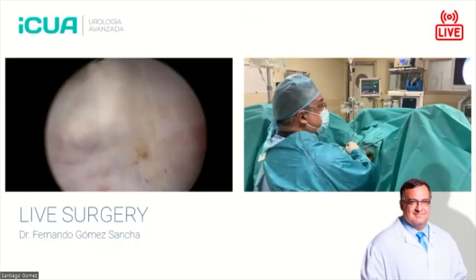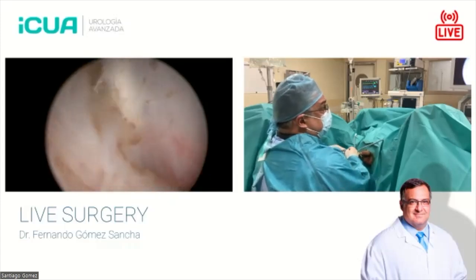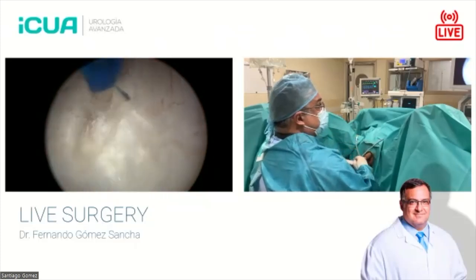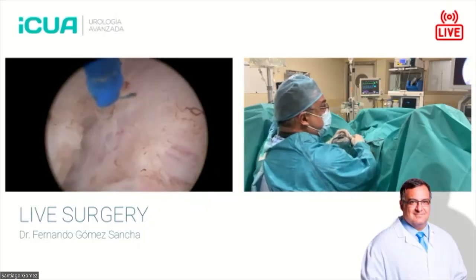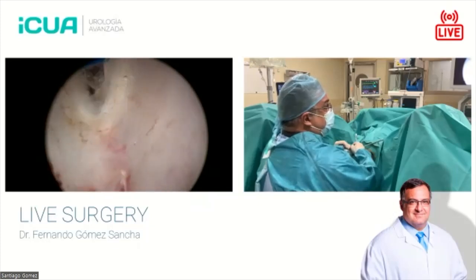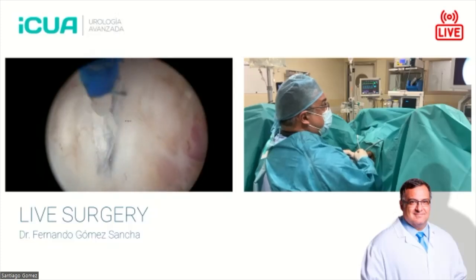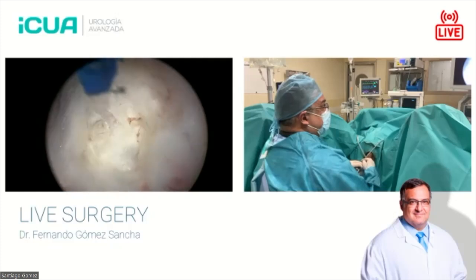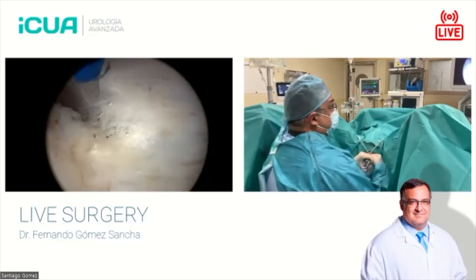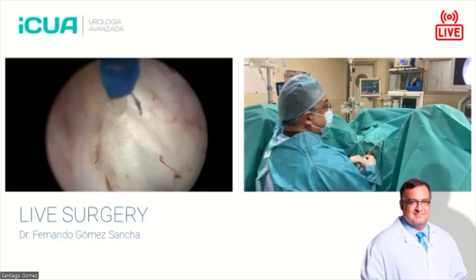But you see, we have excellent visibility, we have excellent orientation, we're just going around following this plane and judging. If I go very deep, I have to point my laser a little bit closer to the adenoma. If I see a nodule, I have to point outside of the line, because we want to take the nodule, as we did before. But I also do these long, careful movements. If we are trying to use the right working distance with the tissue, and you have a very uniform line, it's very easy to move around and keep the right distance to the tissue because the line is uniform. You know what I mean? I don't have to go up, in and out to adapt for a very irregular line. So if you can construct the lines, and follow the lines, and make them uniform, then the procedure is greatly simplified.